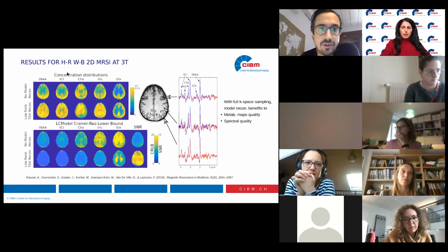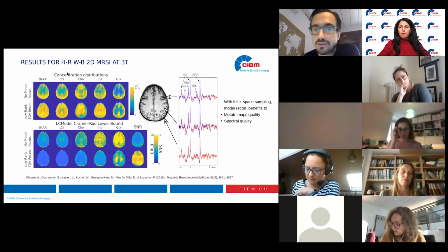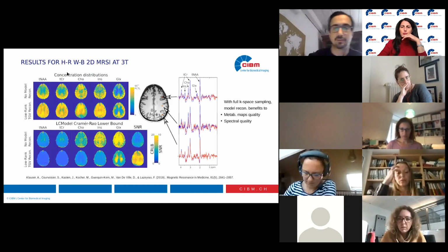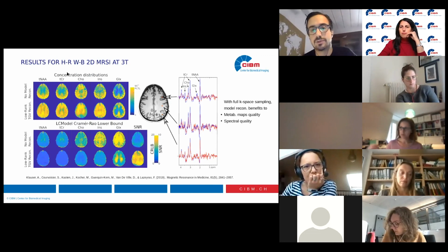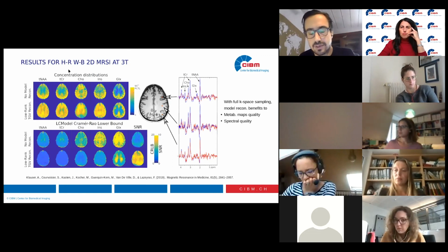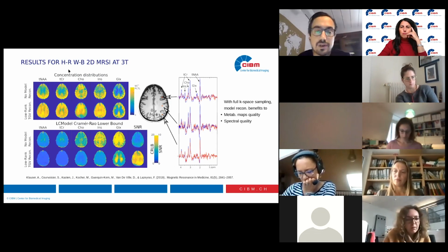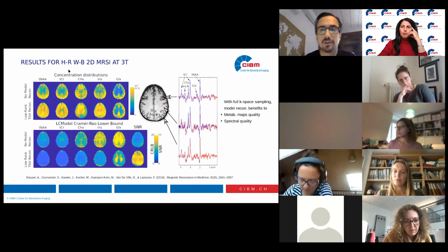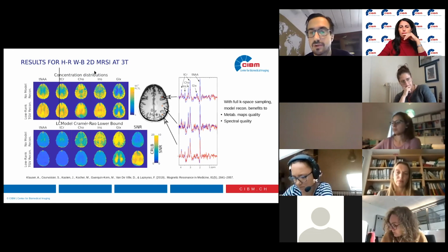Now, you have to be careful with the low rank assumption. If you choose a rank that is too small, let's say that you choose only 8 components, then of course you will only keep signal from the main component, from the main distribution, and you might erase this small variation due to other metabolites. But if you choose something rather safe, 20 to 40 components, you can be sure that normally all metabolites are in. There is some empirical experiment that you can do. You can reconstruct with a various number of components, and you just go down until you see that you remove noise, but you don't affect the distribution of the metabolites.